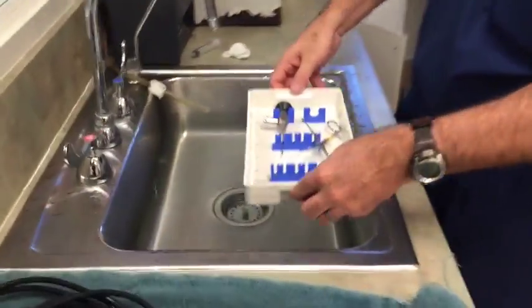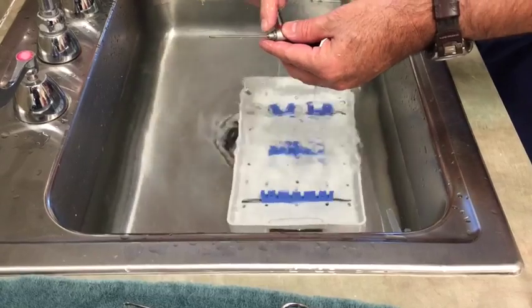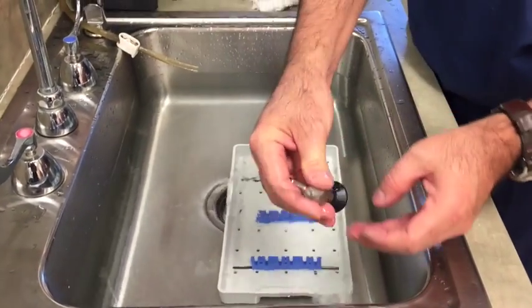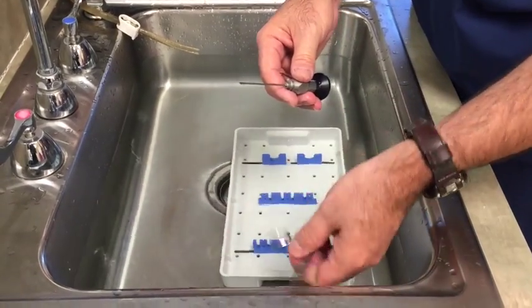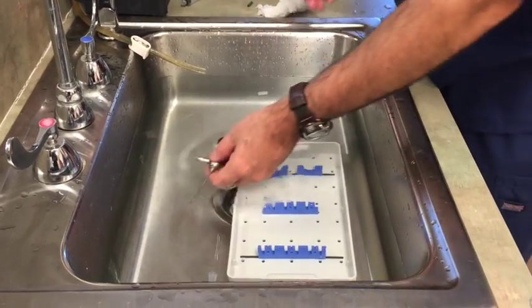So this is the scope. This scope has little tiny rod lenses all throughout, so we really want to be careful. If you accidentally tap it, you're going to damage the scope. So we want to be very careful in how we handle it.